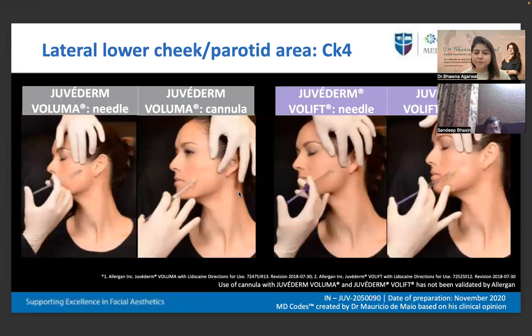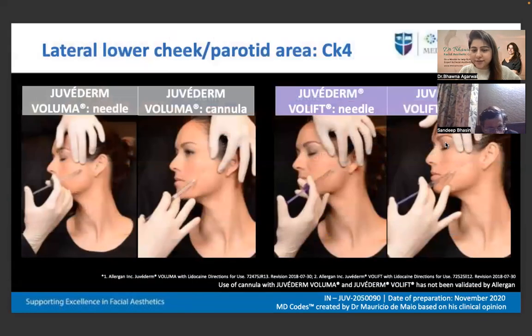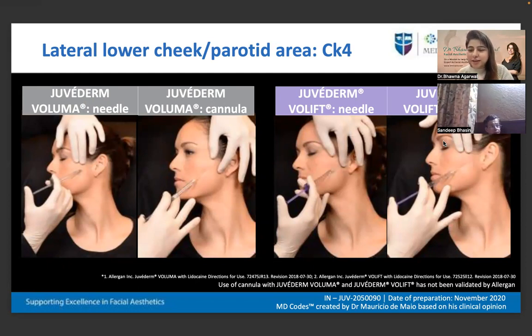So there are some points where you pinch the skin when you're doing it with the cannula. When you're doing it with the needle, lift the skin. So your non-injecting hand is your second brain. It is guiding you during your procedures. So here we can use the needle or the cannula, and any of the products. Here we mentioned the volume is 0.2 to 1 ml. You can inject up to 1 ml also, but that is a bit higher. 0.2 to 0.5 would give you good results. Half syringe each side, 0.2 to 0.5 ml on each side. Because when we are injecting, we are not just putting syringes, we are doing the facials also side by side.